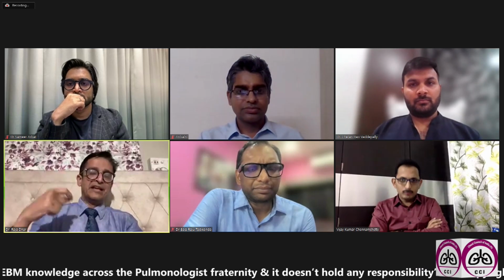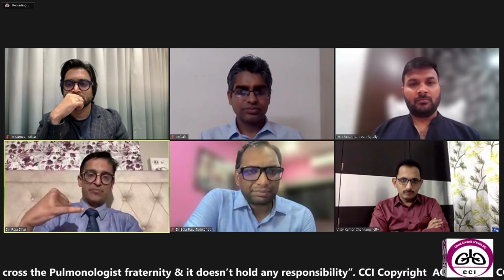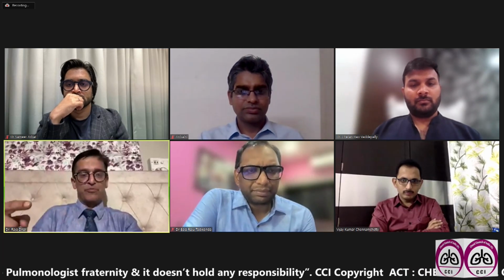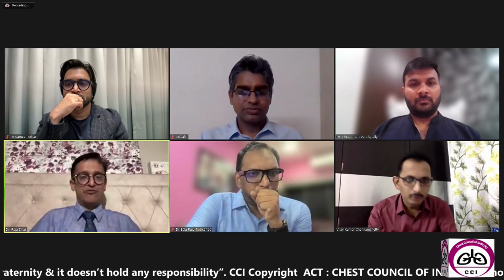Yeah, no, absolutely. And the other thing which Bala said, and Vijay said, and Samir said, all of them said, is the sharpness of the tip of the 1.1. That's the reason it's so good for mediastinal lymph node biopsies, because of the sharpness. And that's the risk that we spoke about when we spoke about transbronchial cryobiopsies. So let's move on.